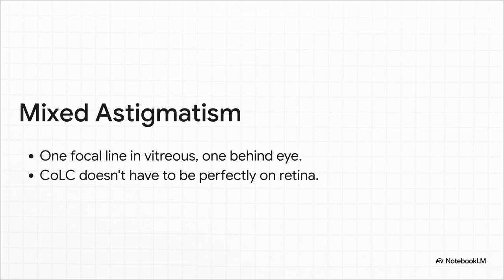Period. End of story. So many residents fall for the trap of thinking the dioptric midpoint between those two lines has to fall perfectly on the retina. It doesn't.